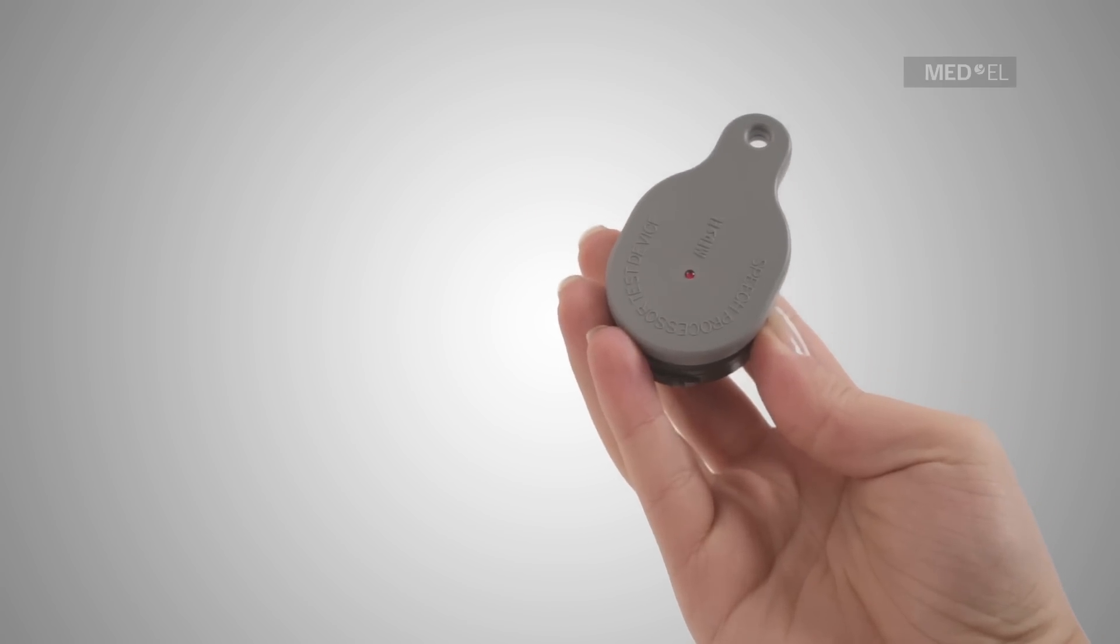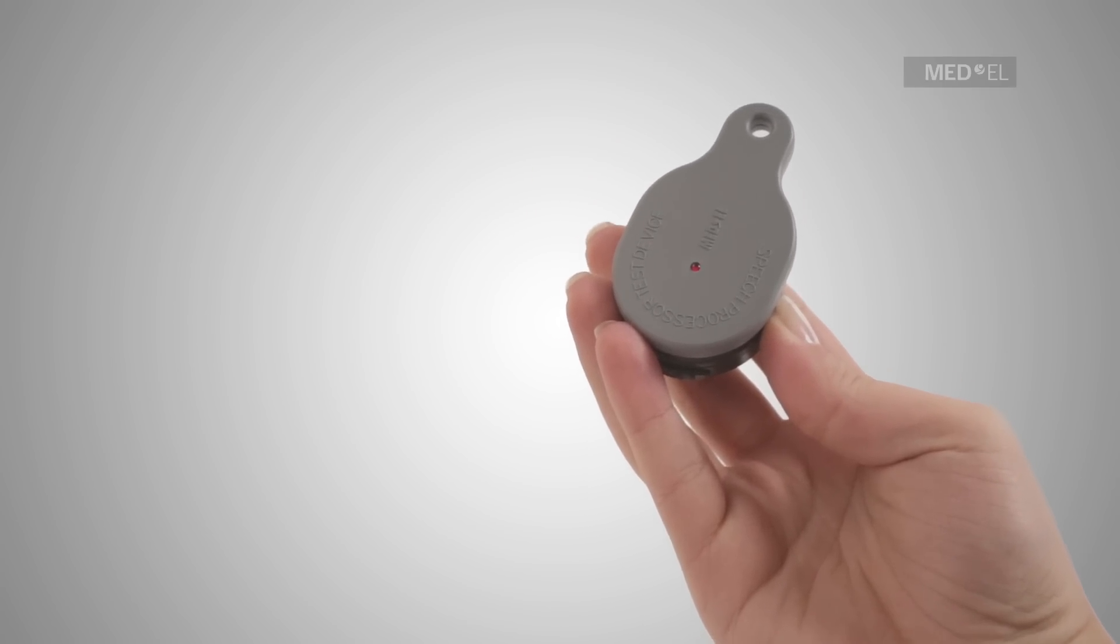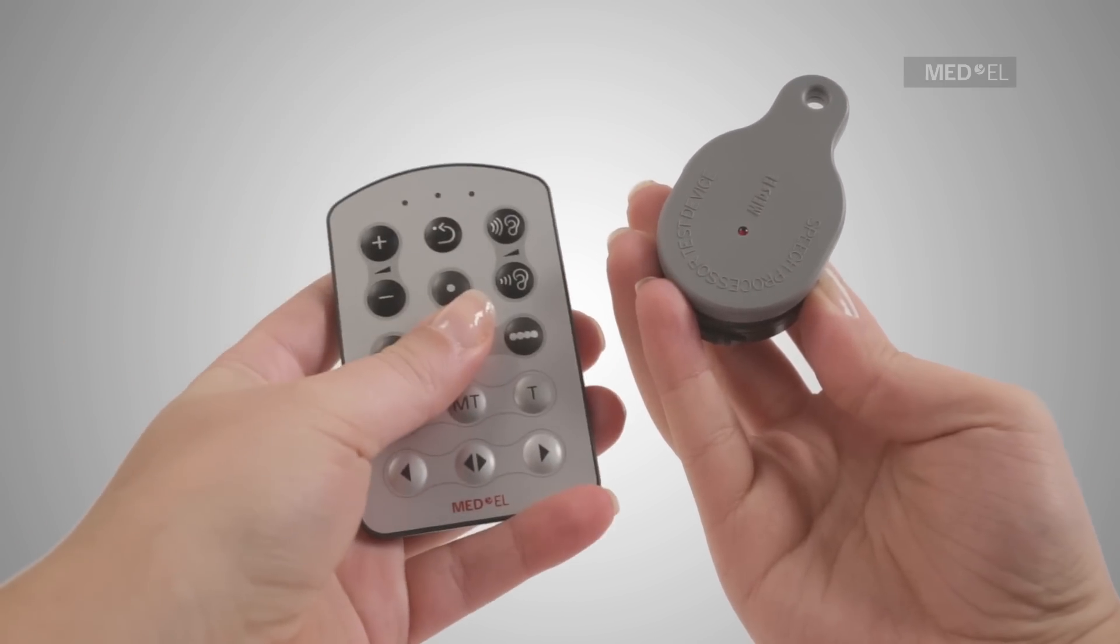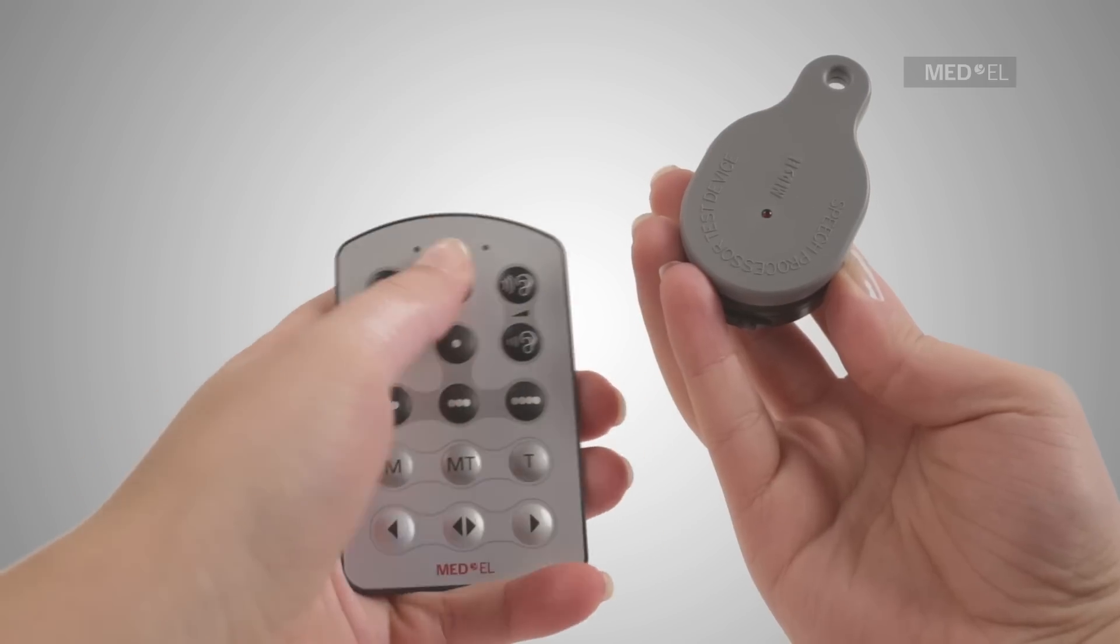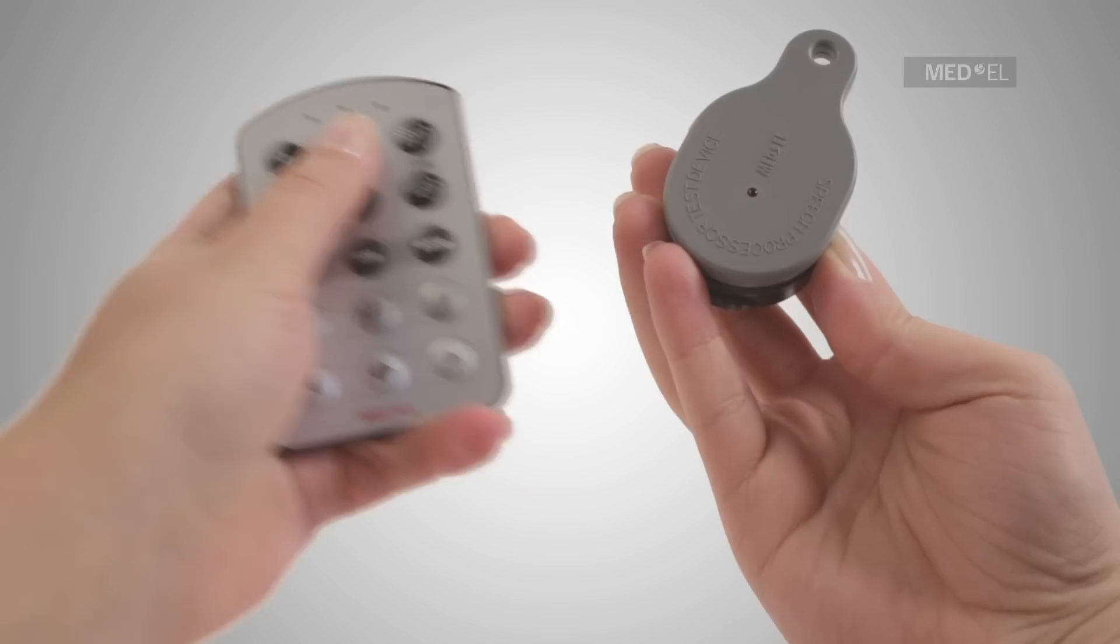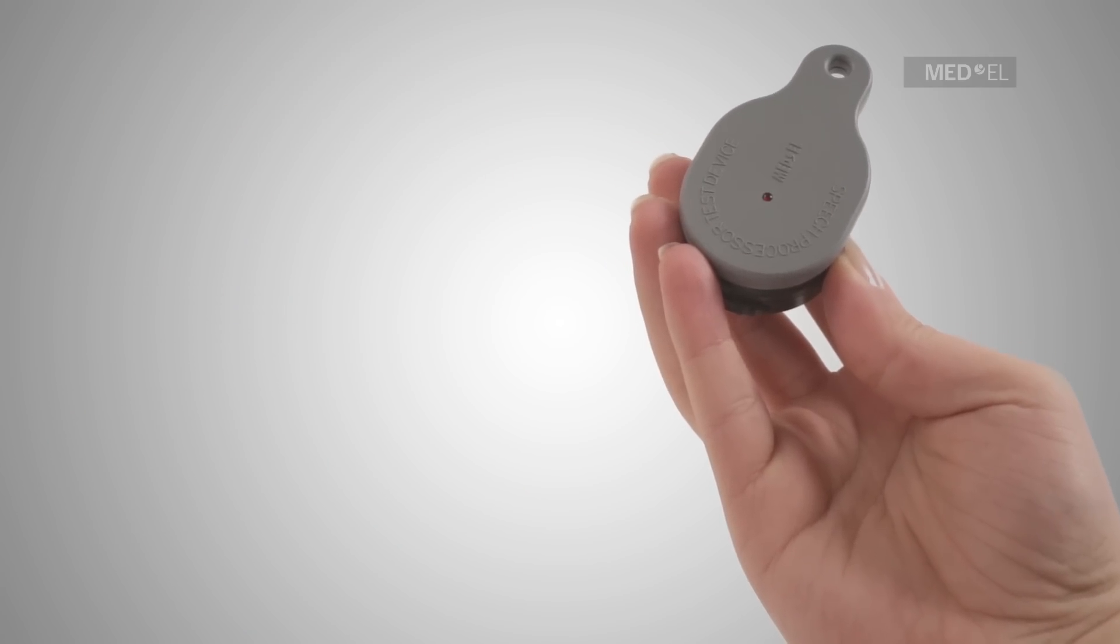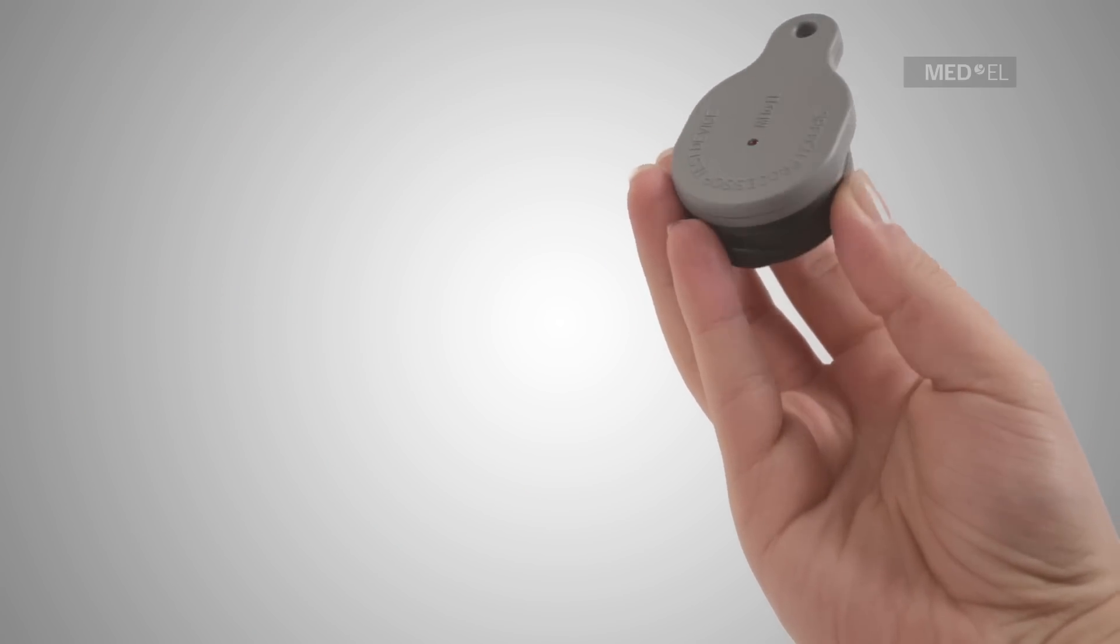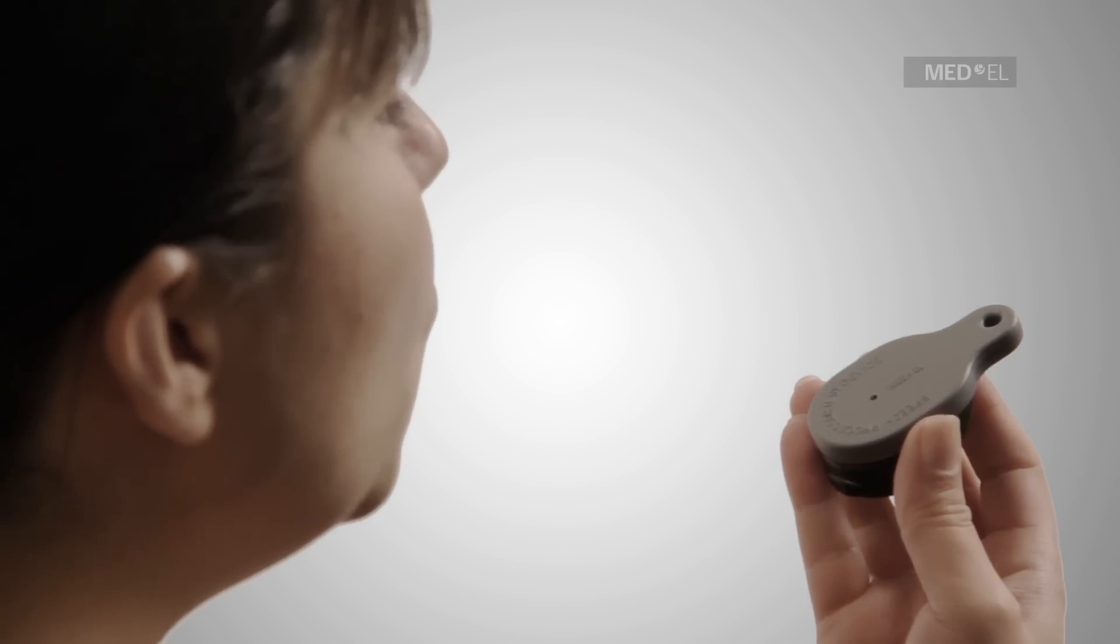If the red light on the Speech Processor Test Device does not flicker or stays on constantly, adjust the volume of the Rondo using the FineTuner Remote Control Unit. After adjusting the loudness, the flickering of your voice should be recognizable.